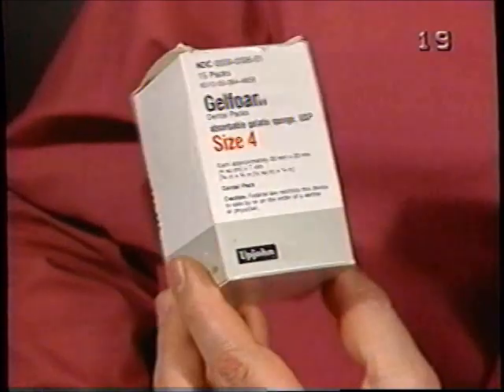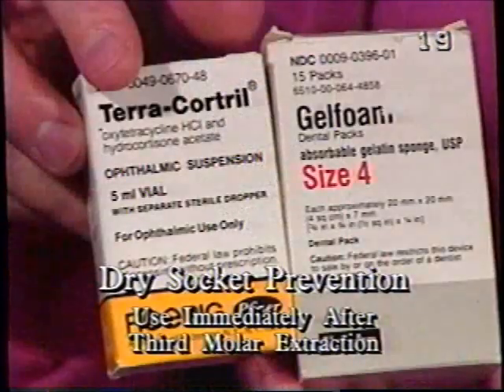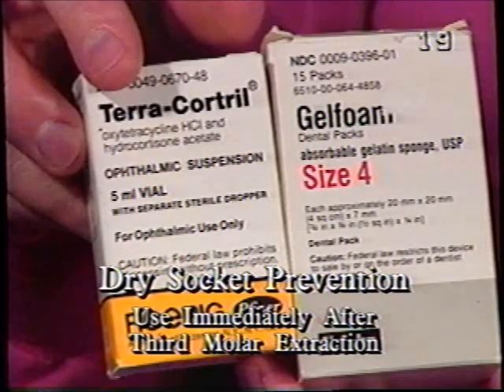Gel foam, here's our bottle of size number 4, with a few drops of ophthalmic, and certainly not the ointment form. You would never use that in a socket because it retards healing, doesn't resorb, and anything with petrolatum, Vaseline, you'd never put in an open socket.